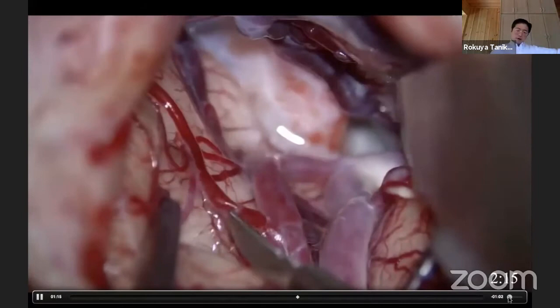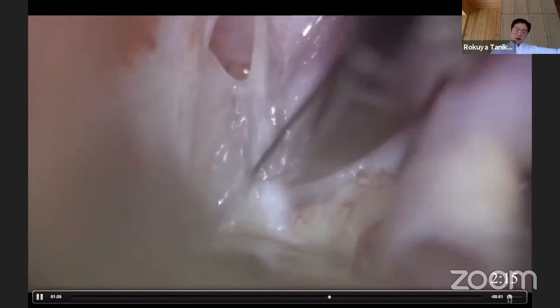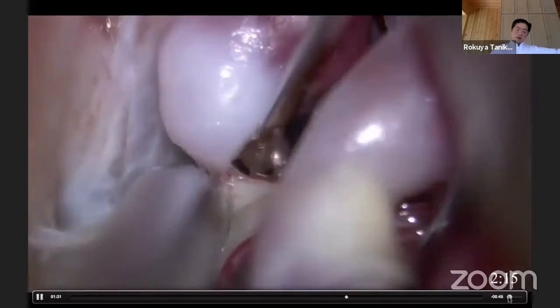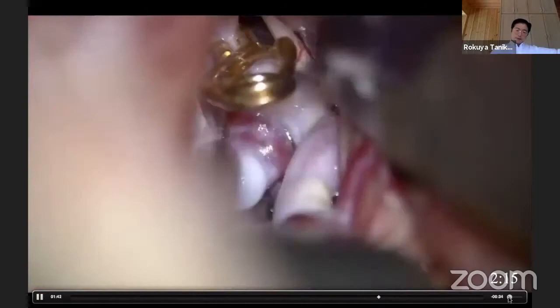Gradually we can approach to the target region. Here is the aneurysm, the oculomotor nerve, and the temporal uncus. The aneurysm is adherent to the temporal uncus. I am trying to put a temporary clip on the supraclinoid carotid.